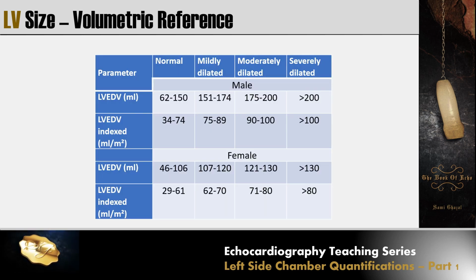Similar to 2D dimension, also in volume we have reference values, and we have to index it to get a more accurate estimation of the size.